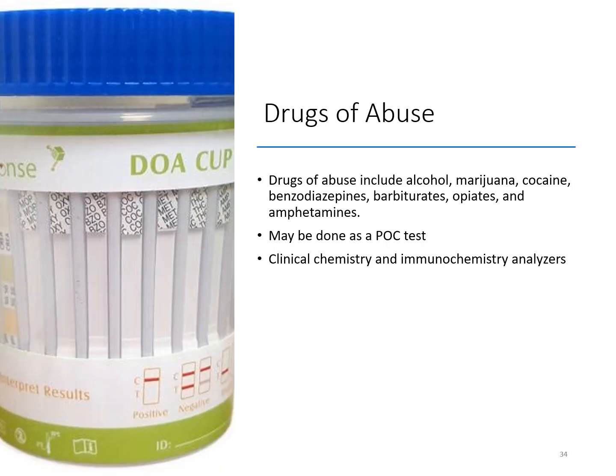So drugs of abuse, including things like street drugs, alcohol, painkillers, or antidepressants, are usually screened sometimes with a point of care test, like what you see here, where the patient will submit a urine sample and then those strips will test for each individual drug.